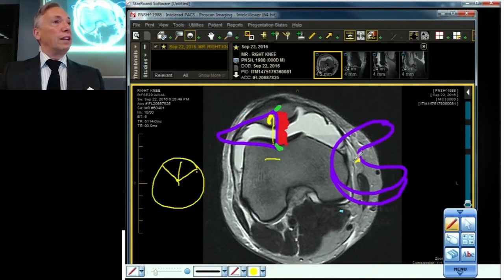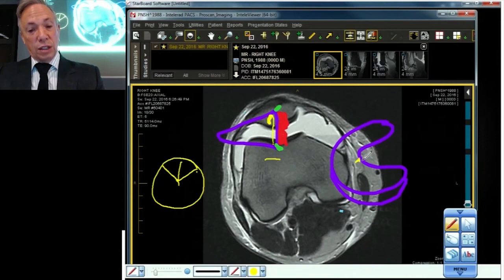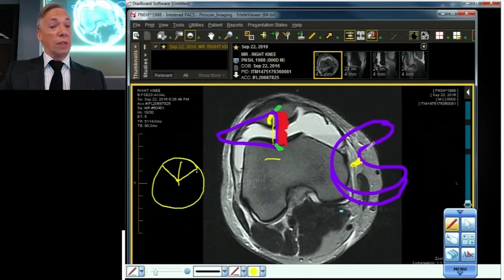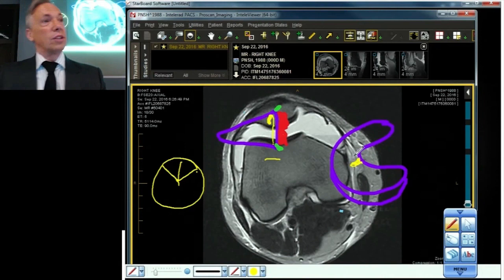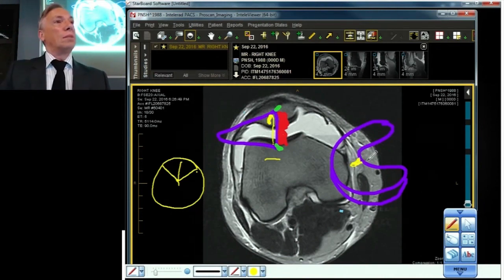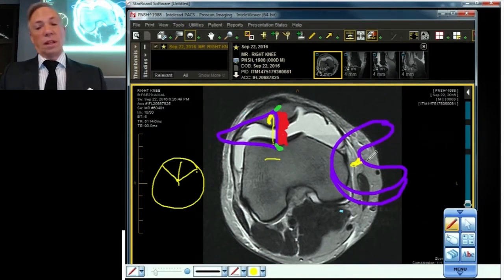Remember, length is completely different for the longitudinal vertical tear. For the radial vertical tear, we're more interested in this character. Now, we also have gapping, you know, the side-to-side dimensions. So the tears can get a little wide, and the more gap they are, the more troublesome they are. So depth is important, the measurement from here to here, greater than 6 to 8 millimeters, but also the side-to-side dimension, because gapping can lead to instability. Instability of what? Instability of the meniscus.